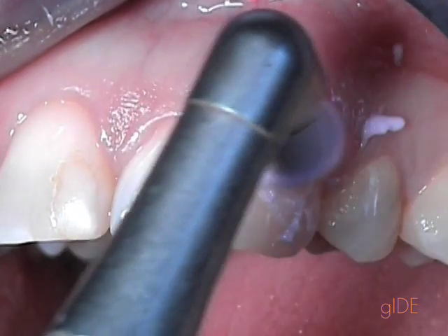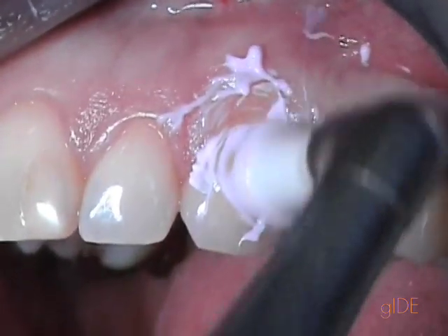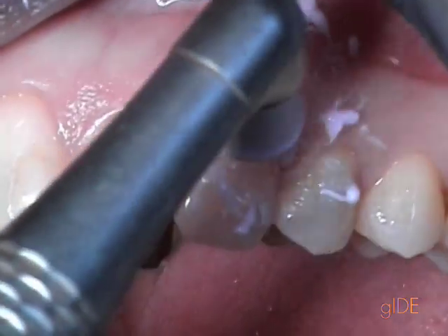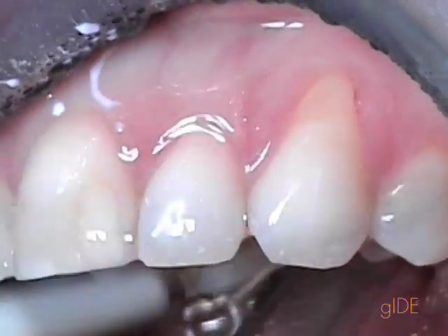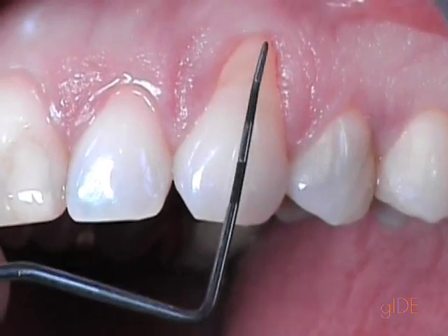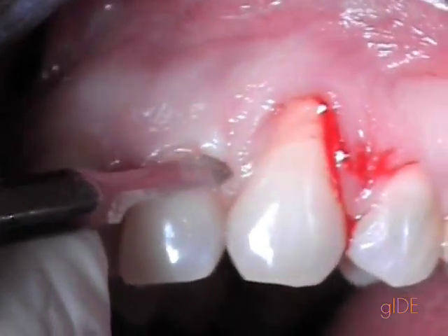You can see she has a gingival recession located on the canine. Even though she went to the hygienist before, I always clean the site very well before my surgery. You can see with a small blade, very delicate.